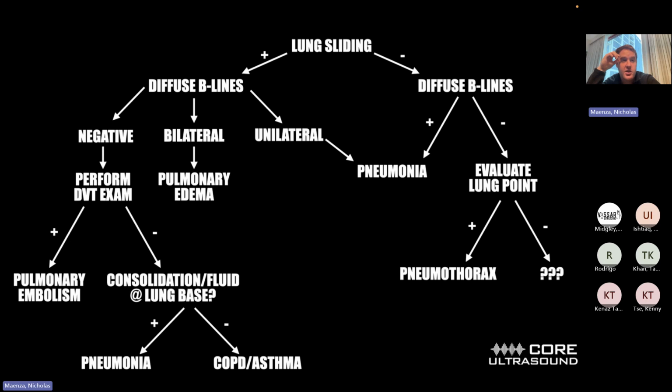It's not necessary. Ultrasound is actually more sensitive for finding pneumonia than chest X-ray. And it's kind of interesting, the patient population you'd be more concerned about pneumonia in, the elderly patients, the ones you would want to admit and watch closely because the likelihood of them dying from pneumonia is much higher. Finding a pneumonia on chest X-ray becomes less sensitive as patients get older, while ultrasound remains a really good tool.